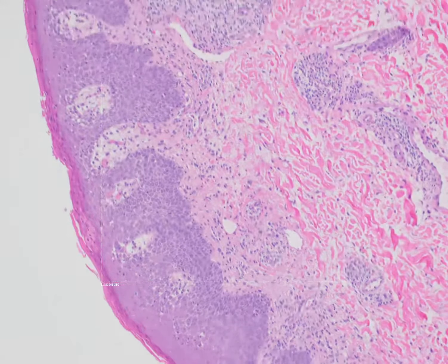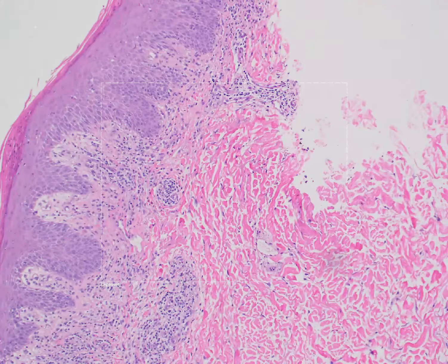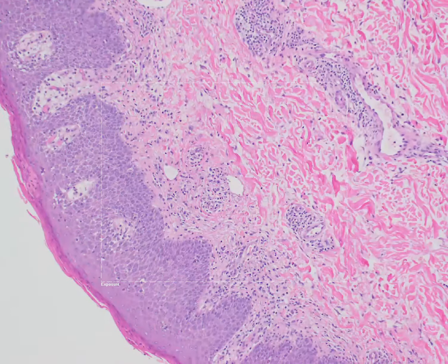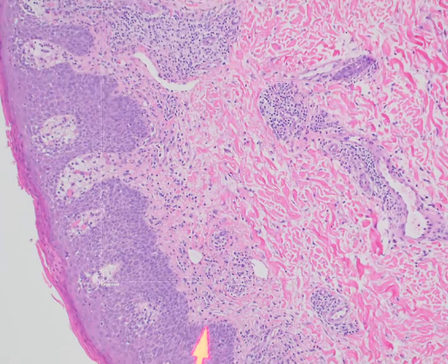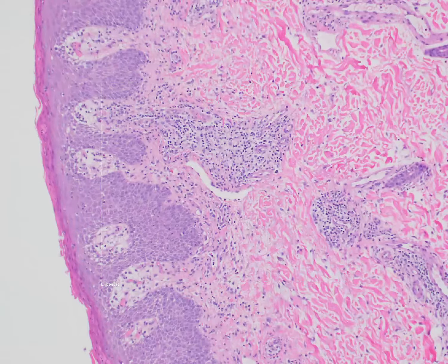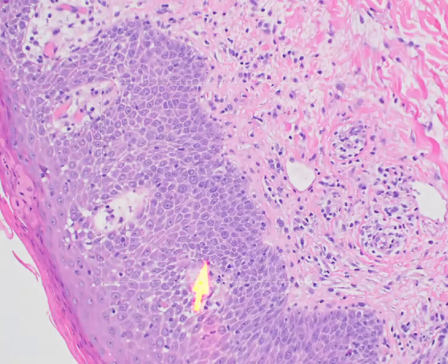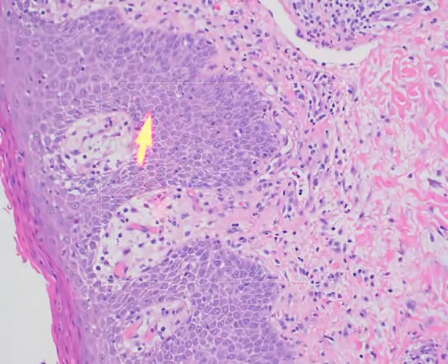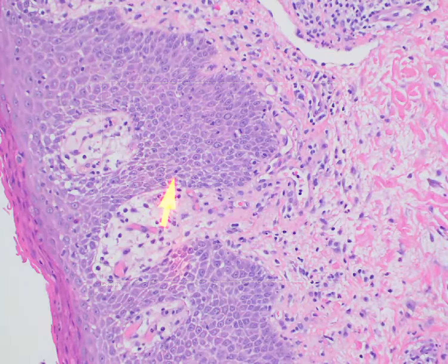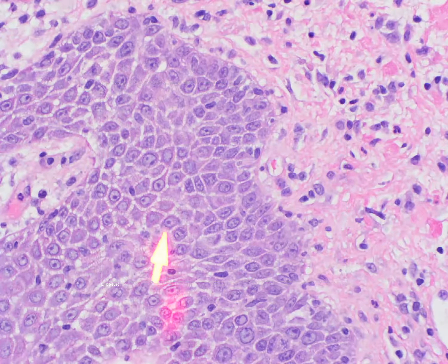The epidermis is regularly acanthotic, so there's regular epidermal acanthosis or regular epidermal hyperplasia, meaning that the rete pegs are roughly of the same length, and that's in contrast to irregular epidermal acanthosis, where they're of different lengths. Another feature for this pattern is the presence of some degree of spongiosis, and we have some spongiosis here evidenced by an increase in the white spaces between the keratinocytes. It's almost as if they're stretched apart to the point where you can appreciate the spinous processes between each of the keratinocytes.